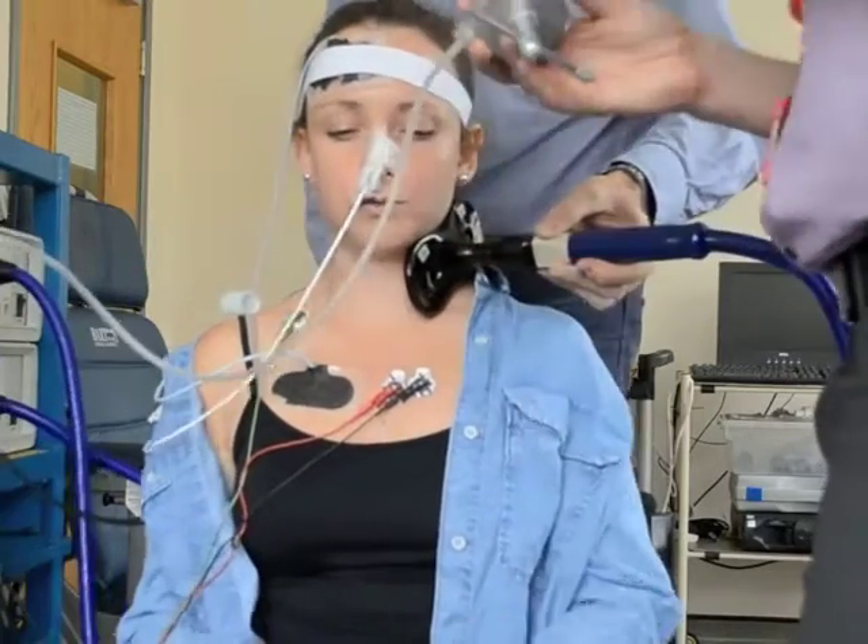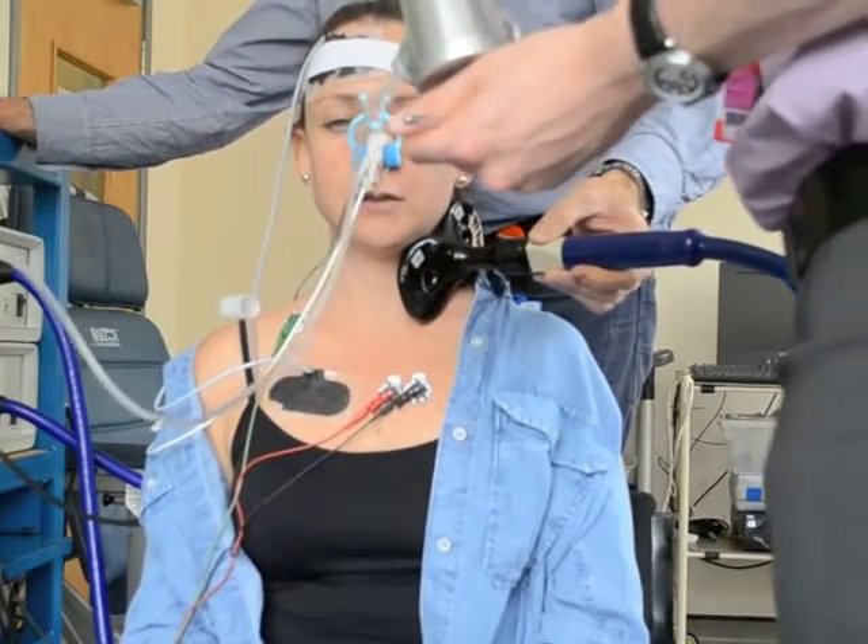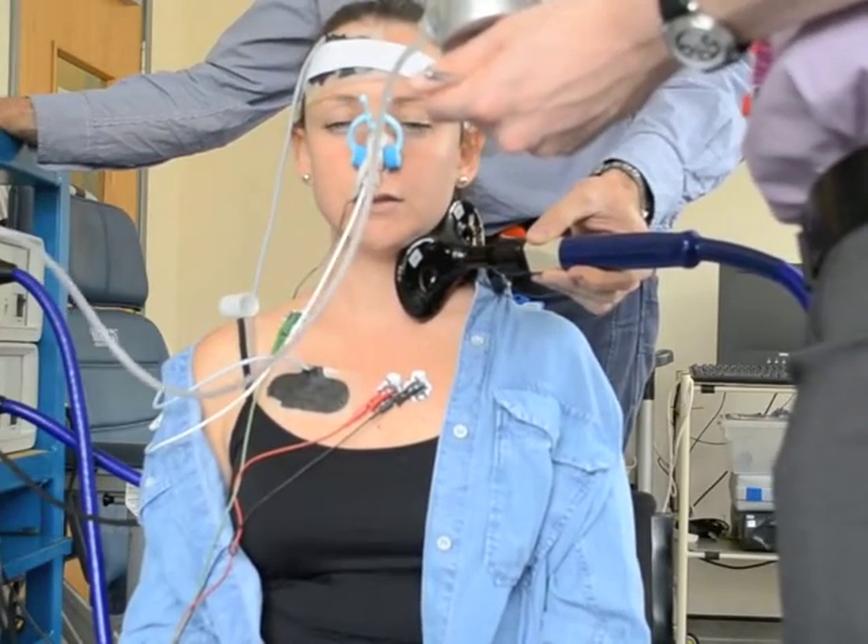This technique is used to ensure that we have an accurate assessment of the strength of the diaphragm regardless of the subject's level of motivation or ability to perform.